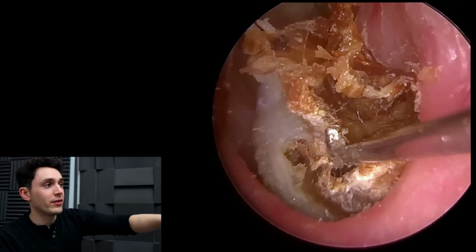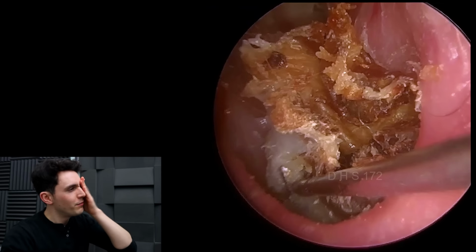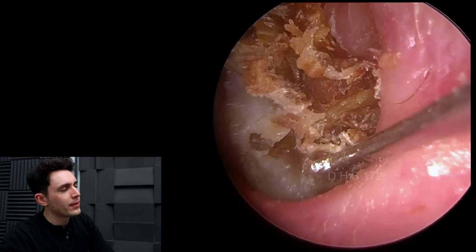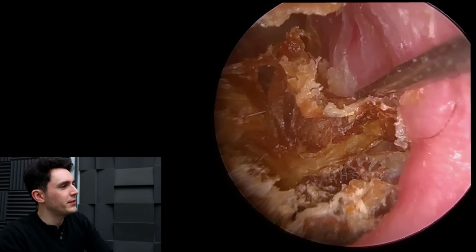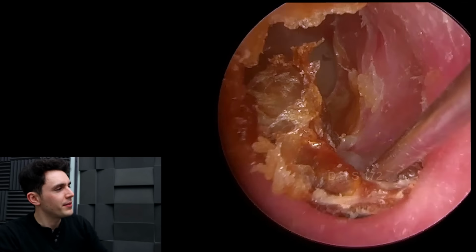And you can see here I'm having quite a tough time. Now you'll see me make a mistake here in a moment or two, but this debris was really just anchored in there, and I couldn't get it out for love nor money. And clearly this suction's not going to lift it out. Crocs, okay, maybe. So right here is where I make the mistake.